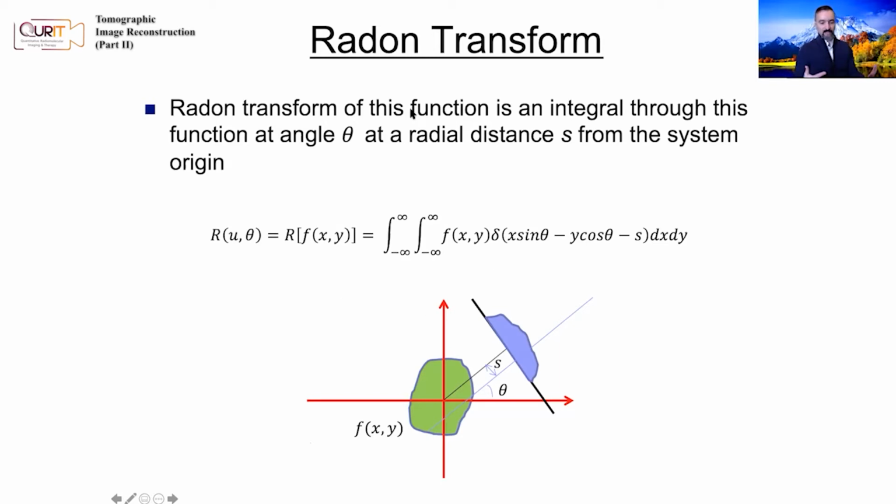So the question really is, and this is Radon, the person who discovered this idea early on, and later, as we mentioned, it was independently also discovered by others. The question is, can you invert the Radon transform? Because you're summing counts along each line, it's not intuitive whether you can actually reconstruct each of these points in the inverse problem. So it might seem like a difficult problem, but it turns out you can actually do that if you're acquiring data along all angles.